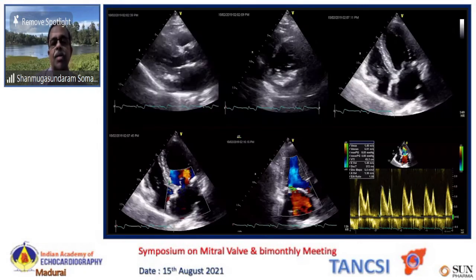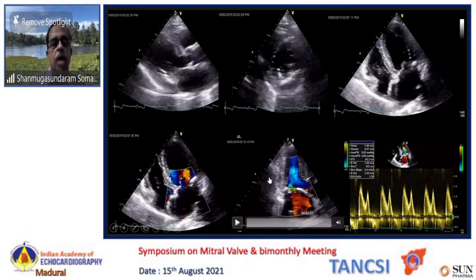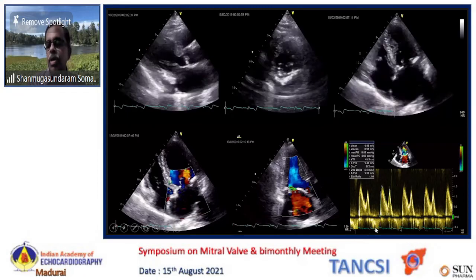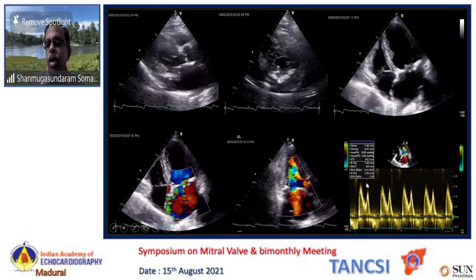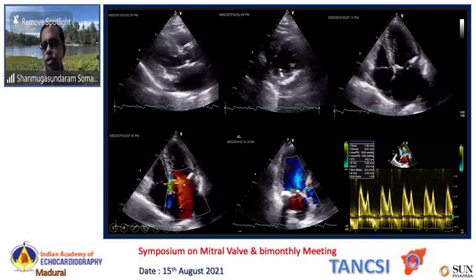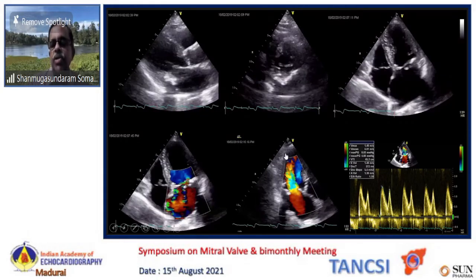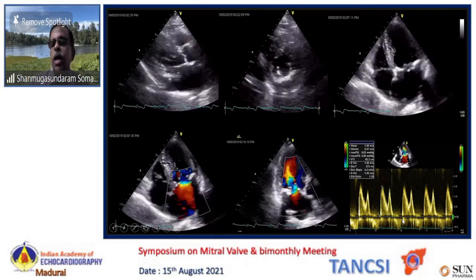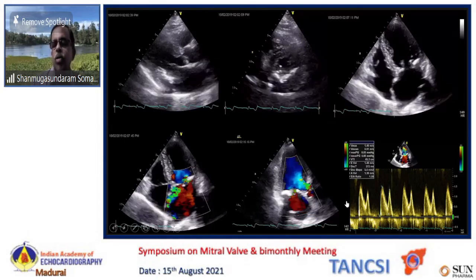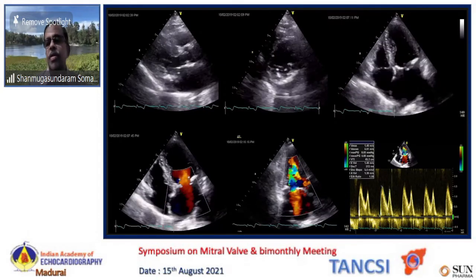The continuity equation probably is very helpful in assessing the severity of obstruction in mitral annulus calcification. This is an illustration where dense calcification of the mitral annulus is causing significant obstruction. But look at the mitral Doppler pattern, particularly the slope, which appears very steep, indicating that there is no severe obstruction. But the truth is, the patient has a very narrow orifice across the mitral annulus. So do not go by the gradient, please go by the dimensionless index as well as the continuity equation.